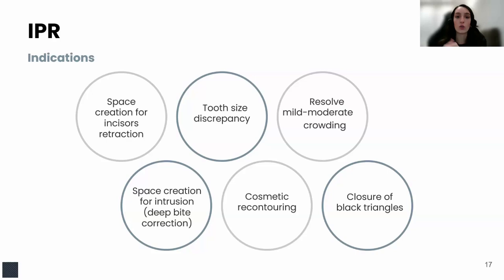Again, this is not something that you need to plan from your end. This is something that your clear aligner provider usually plans within the treatment setup, but it's important for you to understand why it is being planned within a certain case.